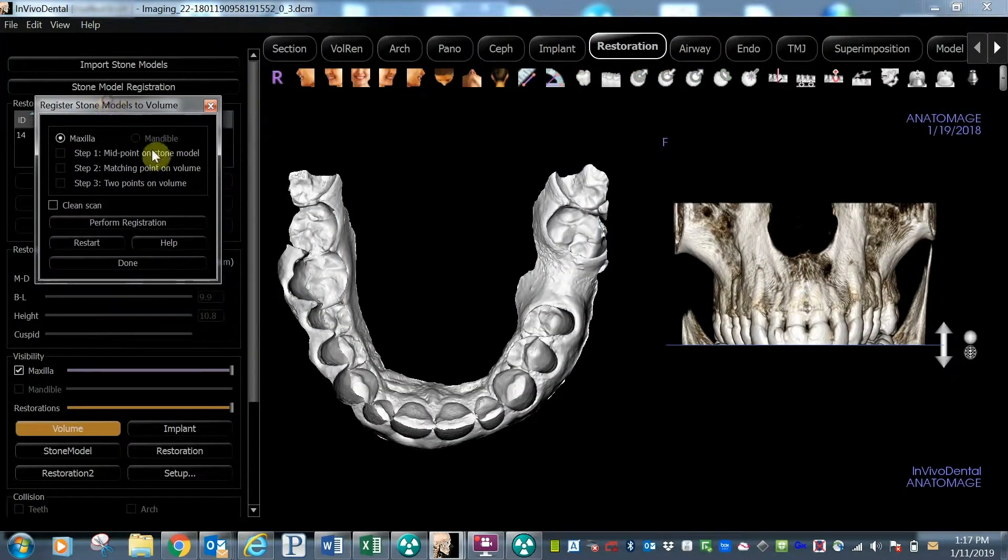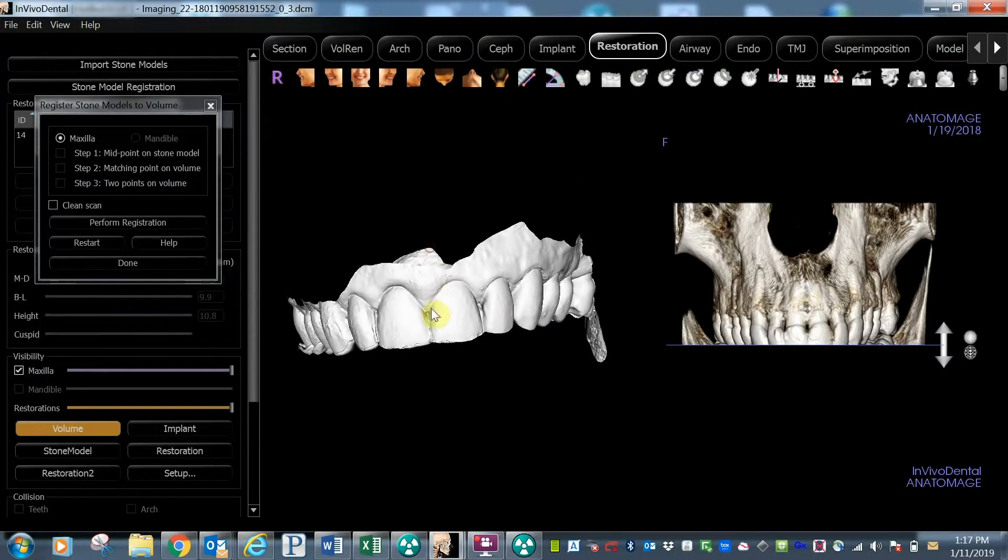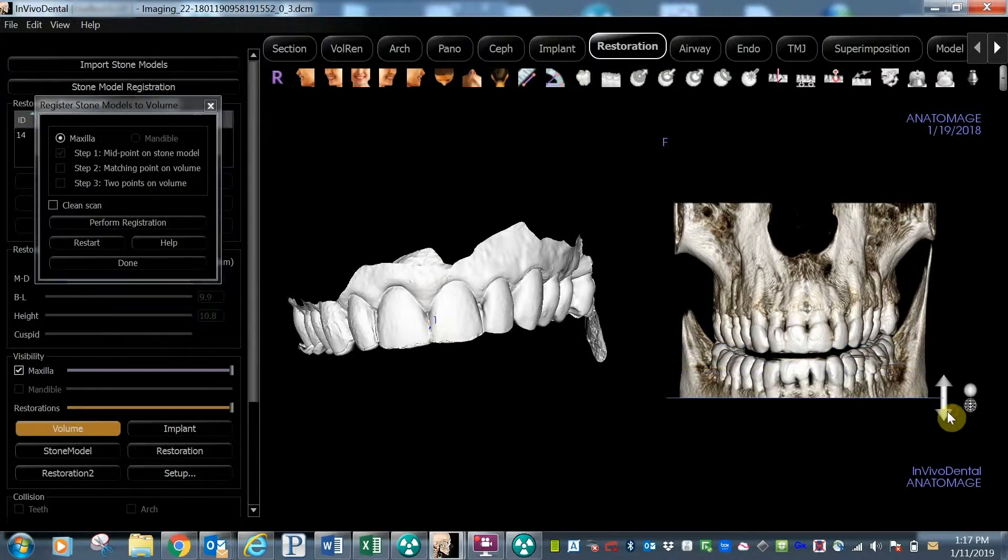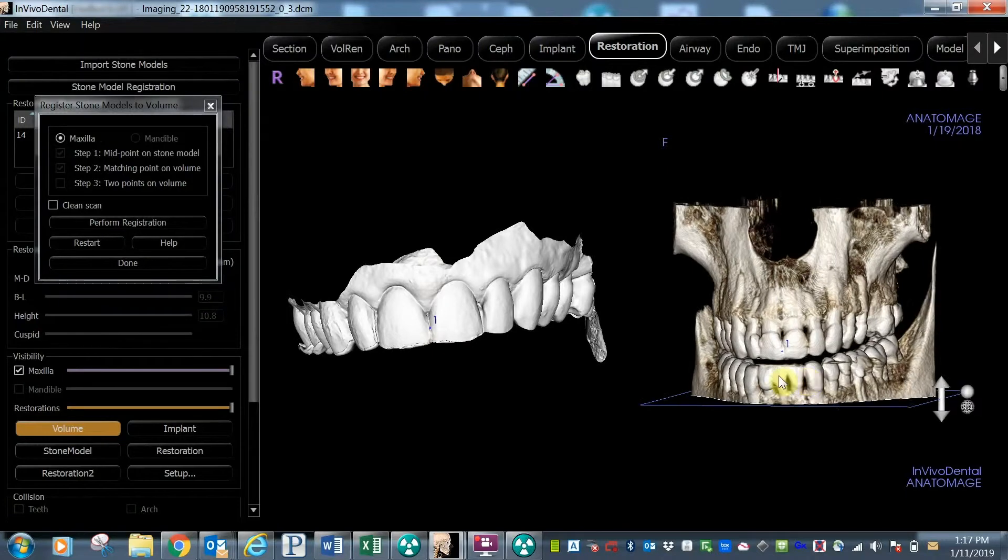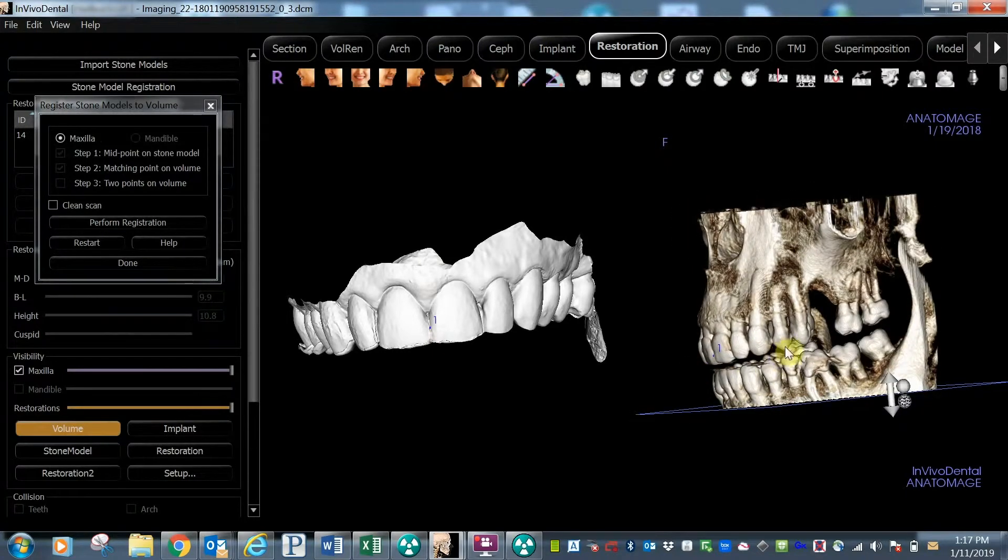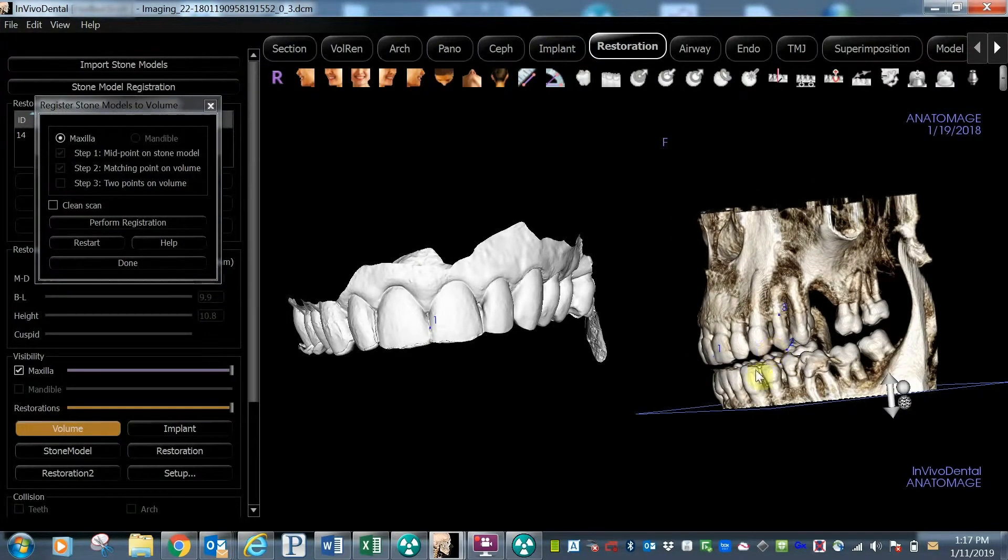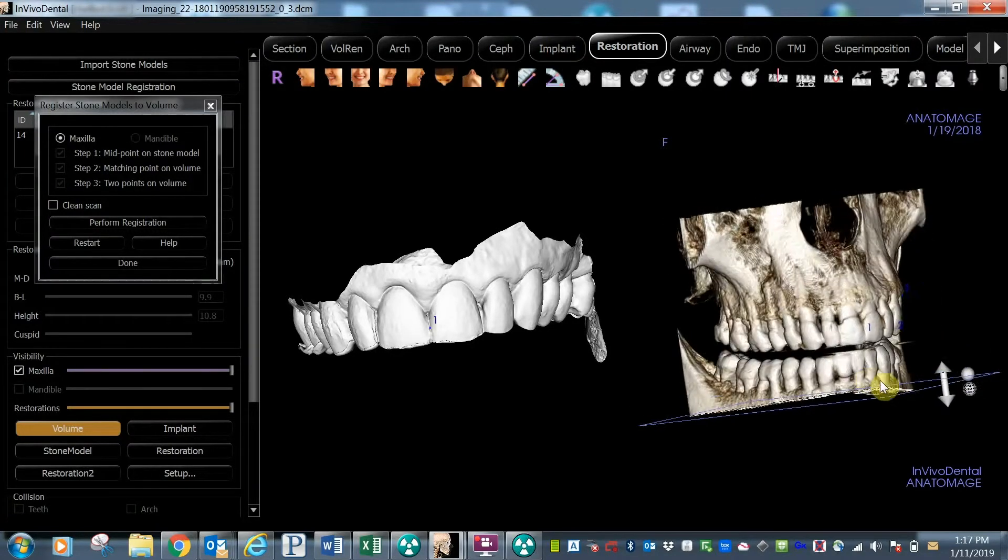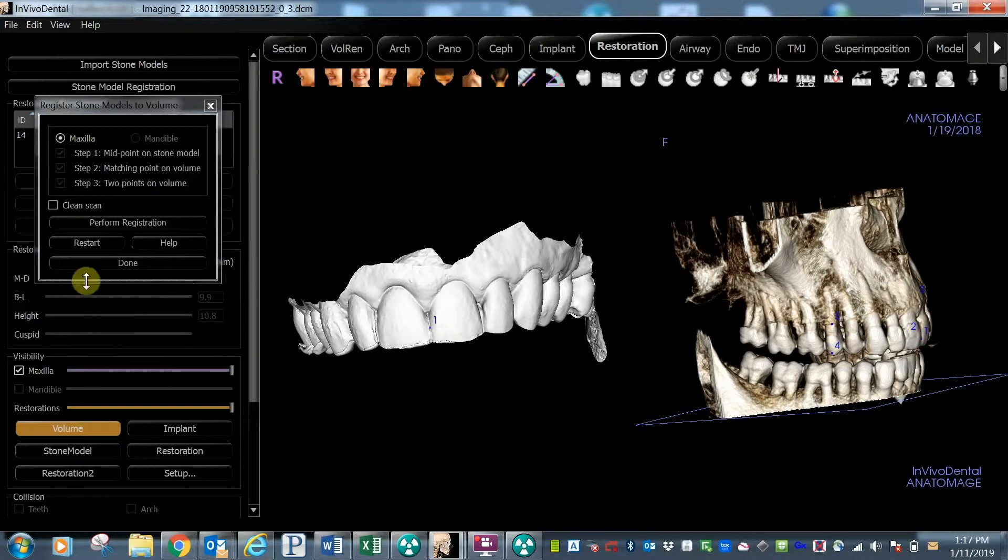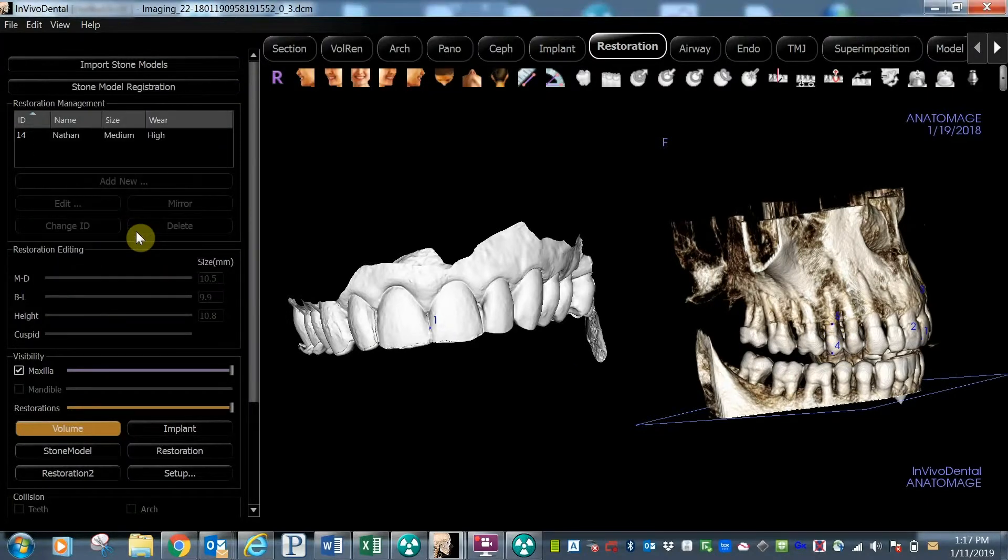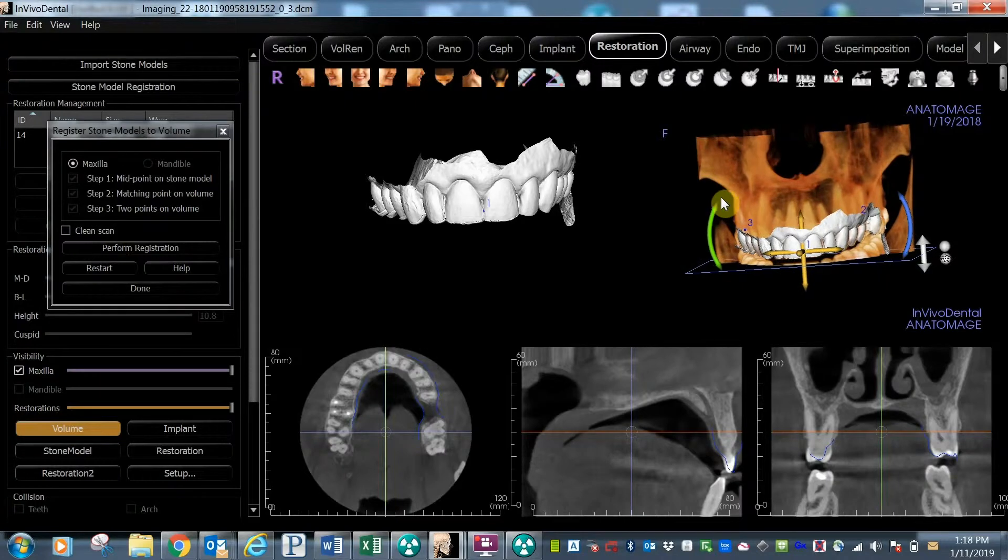Now it is just three easy steps to complete the integration. First, select the midpoint on your stone model. Second, select a matching midpoint on your CT scan. Third, select a few additional reference points on each image. By clicking the Perform Registration button, the software will now merge the digital impression with the CT scan.